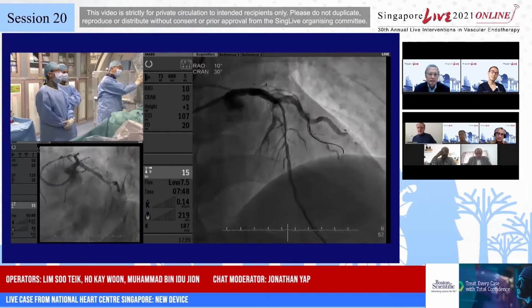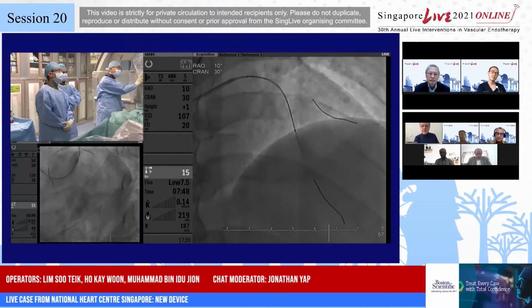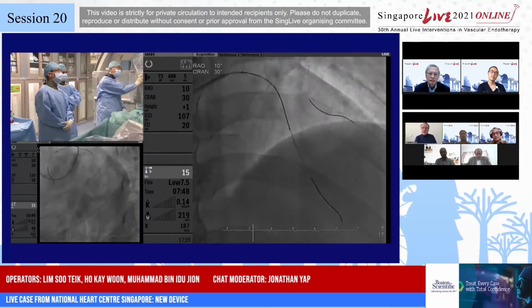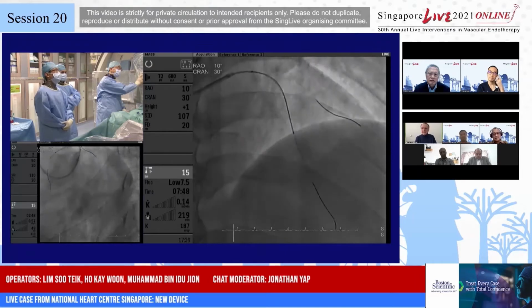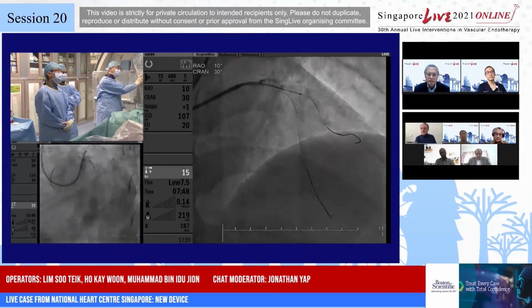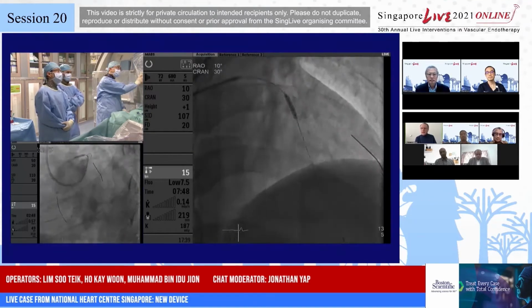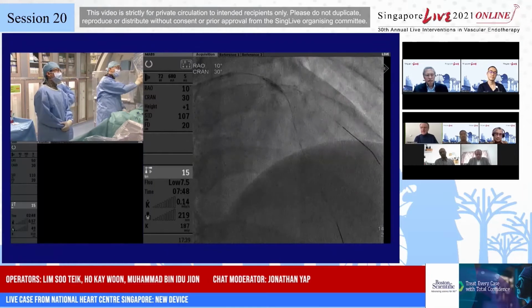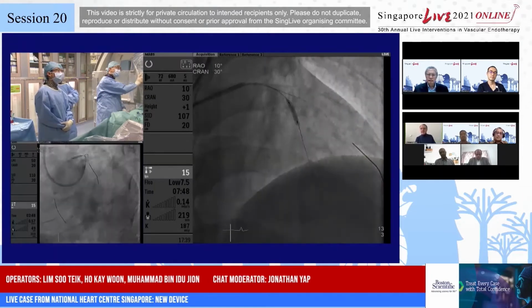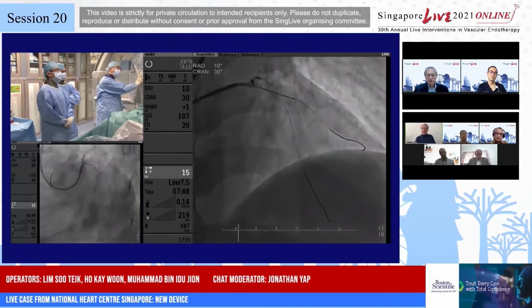Yes. An option that we utilize when you treat a long lesion, especially in the LAD, is to implant a relatively short stent and treat the rest of the vessel with a drug-coated balloon, evaluating the final result with Pd/Pa, pressure gradients, and FFR.